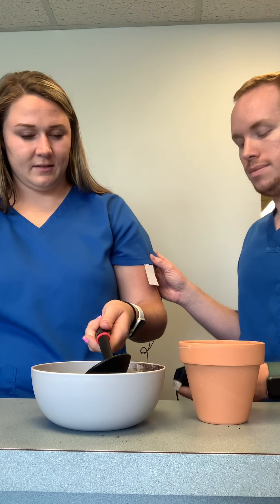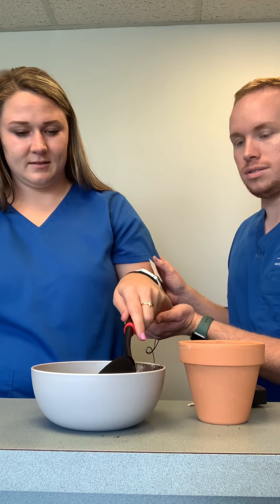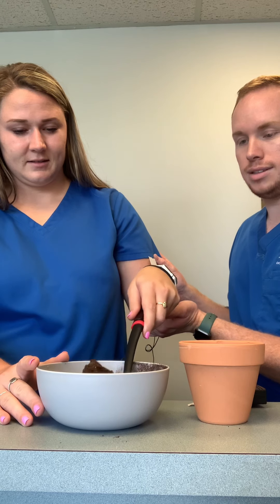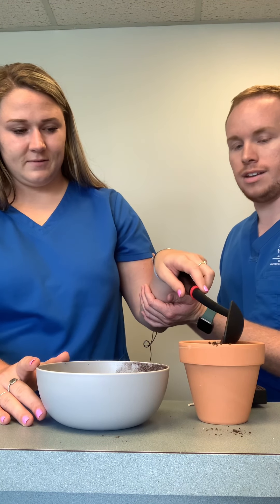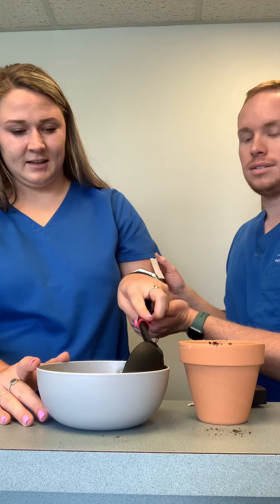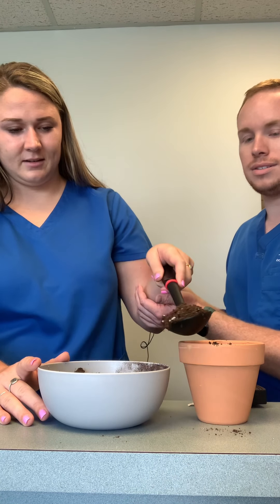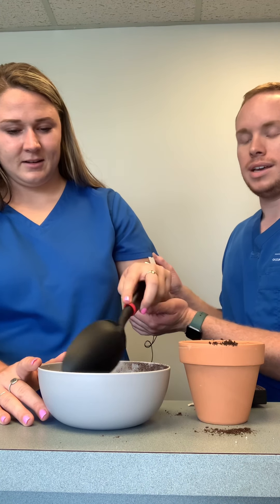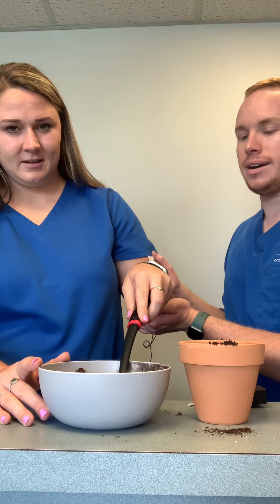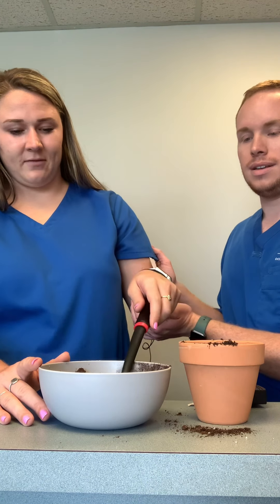So that green light is about to come on. There we go. Do you feel that kind of muscle activation there? I do, I'm feeling it. Perfect. I love to garden. I've got that soil in a bowl for you because I know it's a little easier to get it out of the bowl than it is the bag. I'm making a little mess — it's okay. I've got to plant my own flowers.